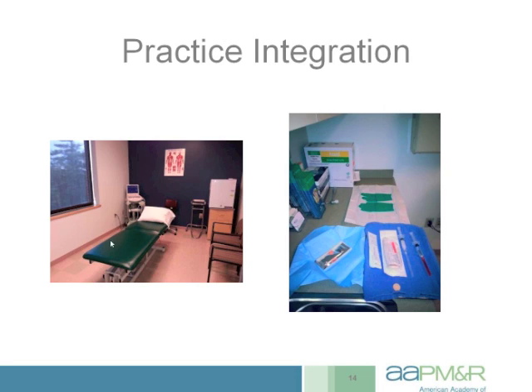Other things that I'll draw your attention to is this is a height adjustable table, and ergonomics are very important, particularly if you're doing multiple procedures a day. So you can raise and lower the patient, and this table also has the ability through a wheel dropping down to be moved if necessary. We do some Botox procedures at my office, so we have a refrigerator here for Botox. And I don't really have a problem with friends or family members being in the room for ultrasound procedures, so we do have an extra chair.